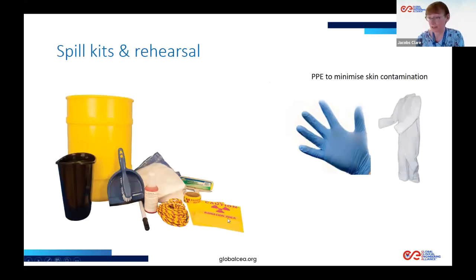So we have to have things like a spill kit, which is a pre-prepared box or kit with all the things in that we need to decontaminate if there was a spill. And operators usually use, on a routine basis anyway, disposable gloves and disposable whole body suits.